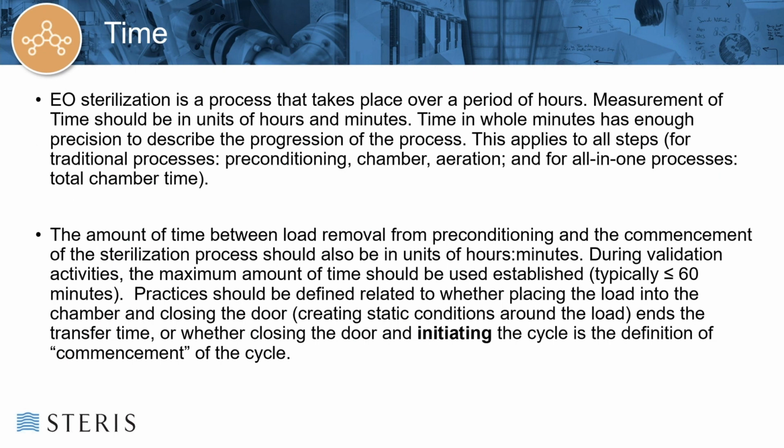time. So if the time on my process goes over by 2 hours because something happened with the sterilizer and it wasn't able to step into the next process, and so my cycle ran long, 2 hours, 4 hours, 6 hours, you know, if there was a power outage and the machines actually just completely shut down and they couldn't get the product out of the chamber for an extra 6 hours, did it damage your product? How much time can you actually allow the process to run without the heat inside the chamber damaging the product? That's the main question.